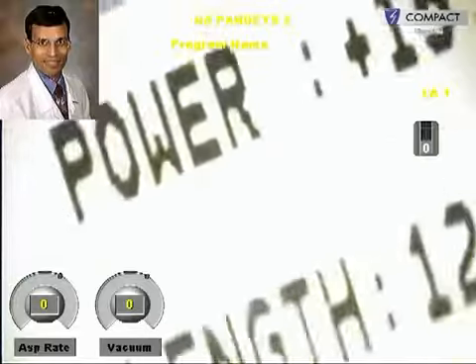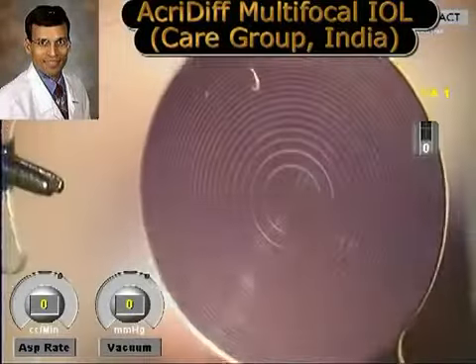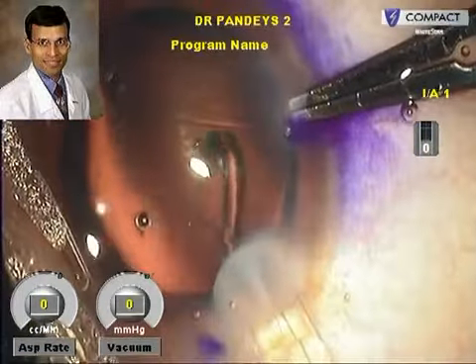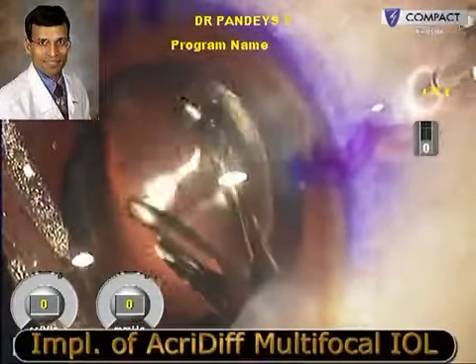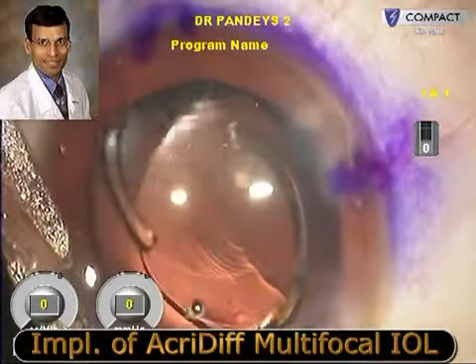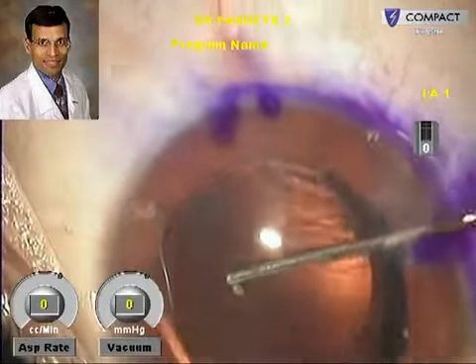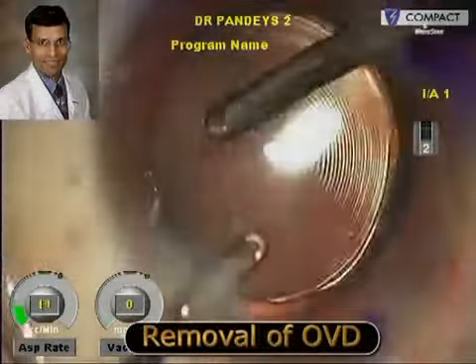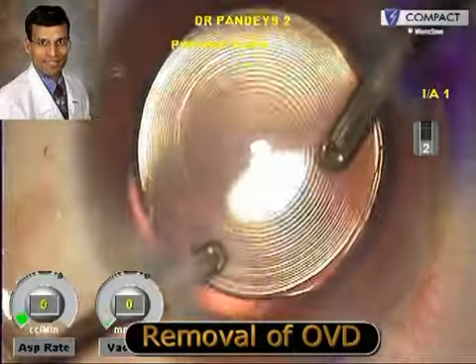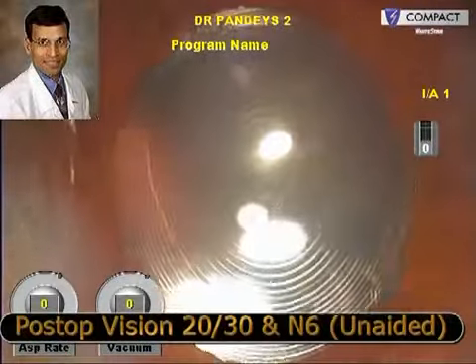Next, we implanted an AcriDiff multifocal IOL, again available from Care Group India. The standard practice is to implant one IOL into the bag and the other into the ciliary sulcus, but in this case we implanted both IOLs in the capsular bag because for both the toric and the multifocal IOL, proper centration within the capsular bag is crucial to their proper functioning and good refractive results.